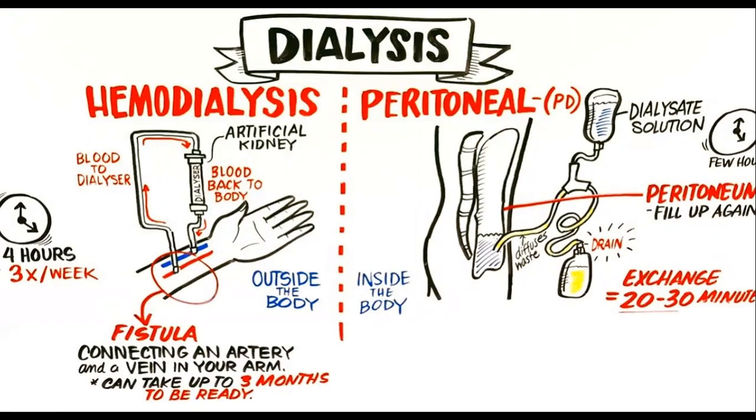So, the difference between hemodialysis and peritoneal dialysis. Already you know, peritoneal dialysis is a temporary process, and we use the hypertonic dialysate solution. You see the dialysate solution passing through the peritoneum, and to remove the waste product, you can see another channel here.